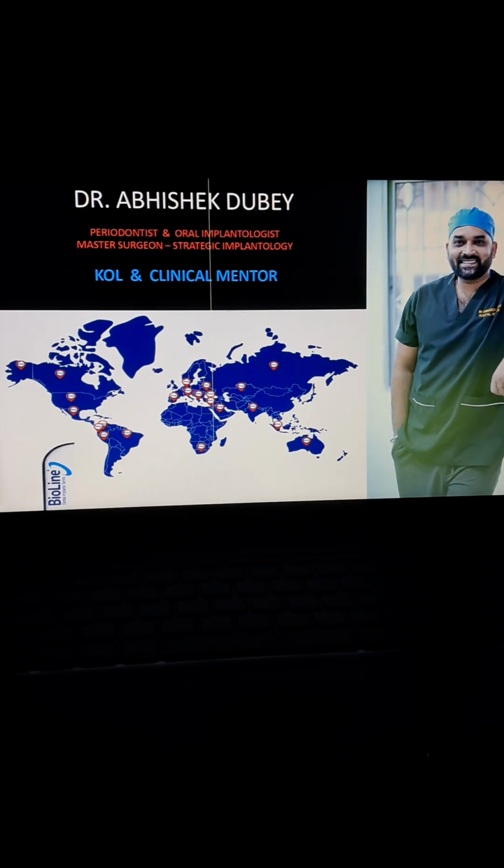I'm back again with a case discussion. I did this case 3 to 4 months ago. It was a segmental rehabilitation in the anterior region using corticobasal implants and PFM prosthesis. To give background about the case, the patient had aberrant, congenitally placed teeth along with multiple situations of deep bite and cross bite.